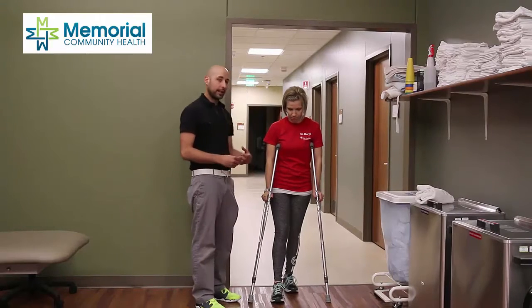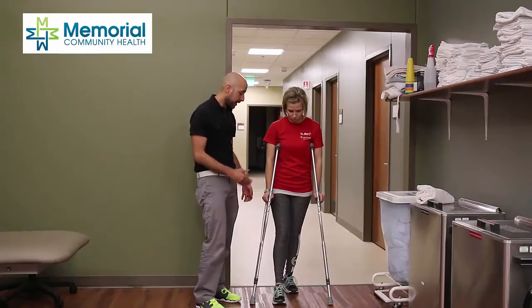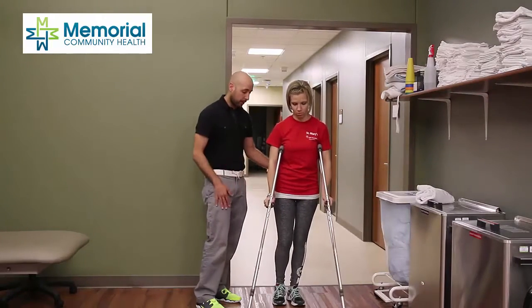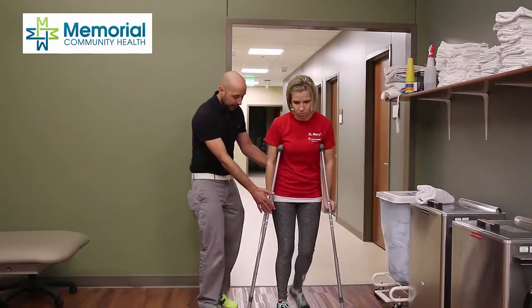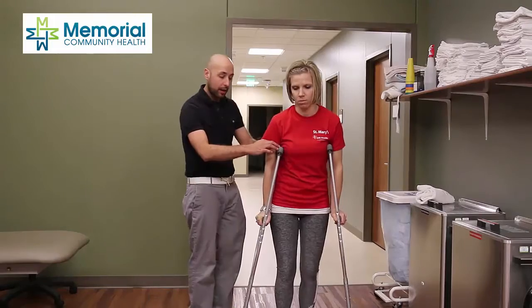We're going to still utilize the same progression as the crutches move first, then our affected leg, then our good leg, and we're going to step into the crutches, not through. Crutches, affected leg, into. We never put our armpit down onto the crutches.